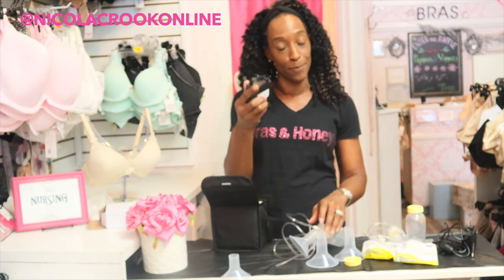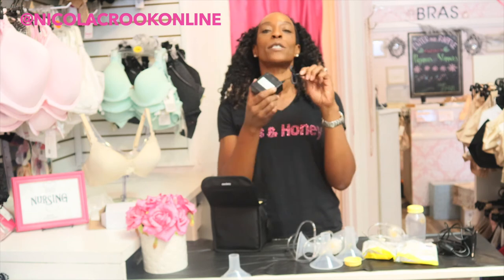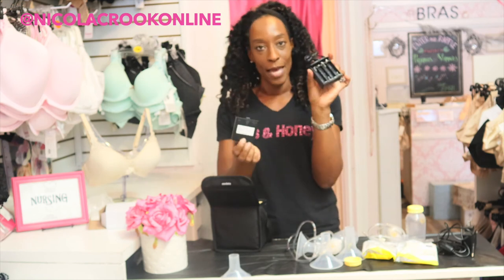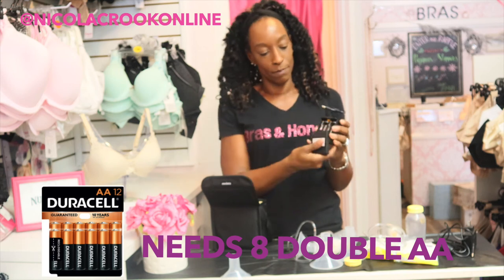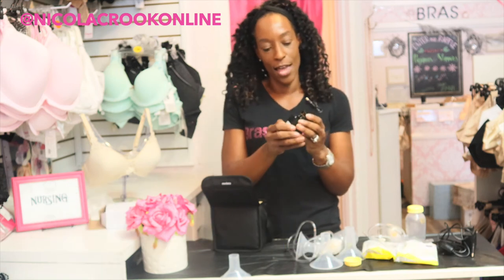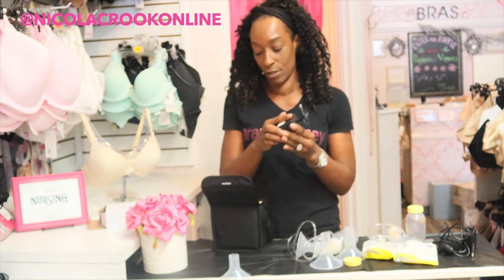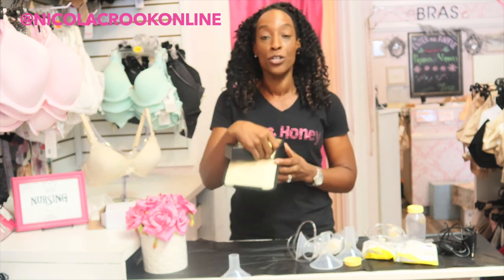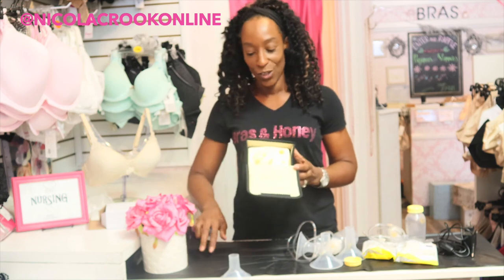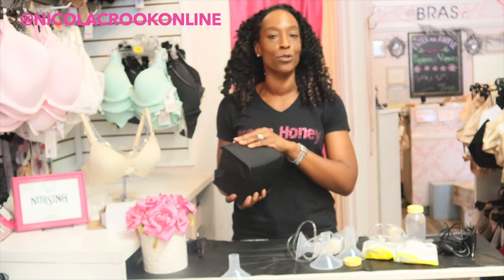The final feature of this breast pump is it comes with a battery pack so you can use it on the go. All you need are eight double-A batteries — they go in both sides — and you plug it into the power connection right there, and then you can use this pump on the go. It's really simple and really easy to use.